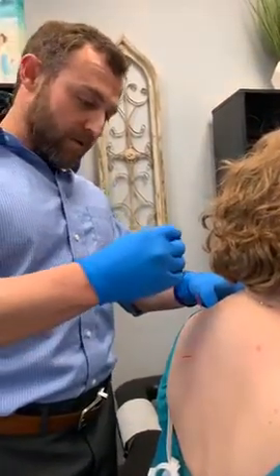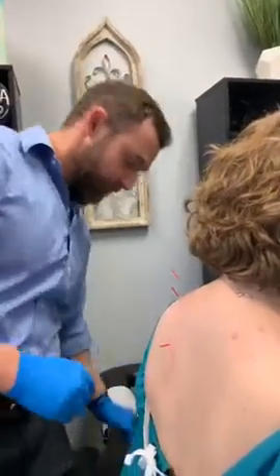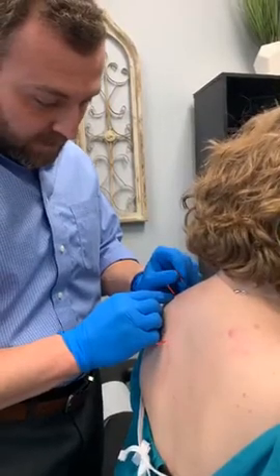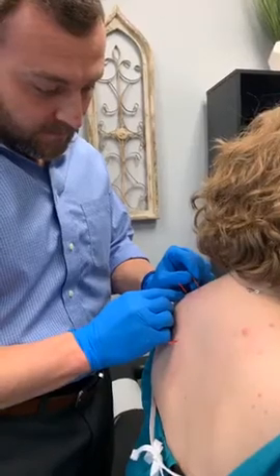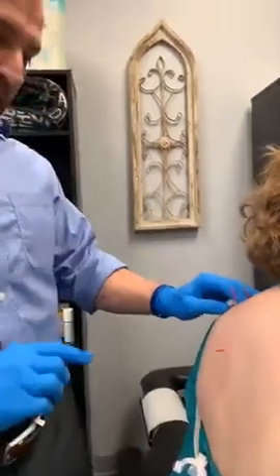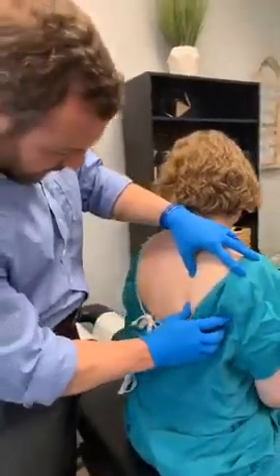So we'll do one more right in here. Okay. We just take this in really gently. She'll feel it right about here. Okay. That one went just a little bit deeper because it was a heavier knot. On this side here, we'll come around to this shoulder blade here.